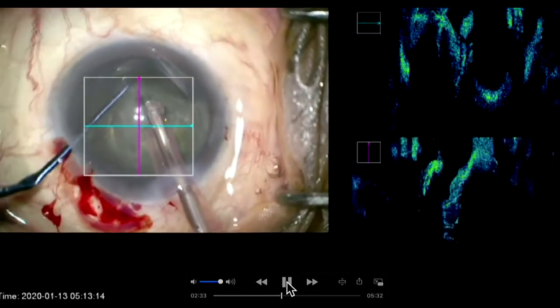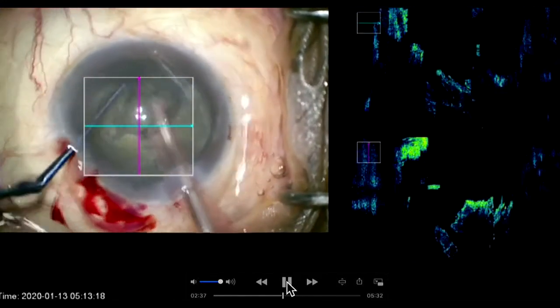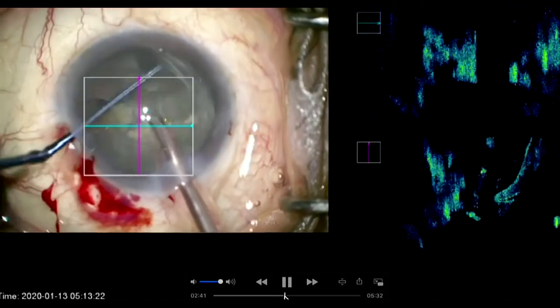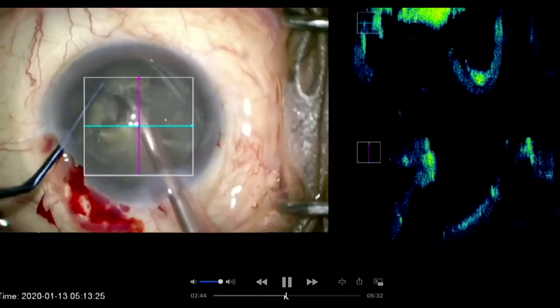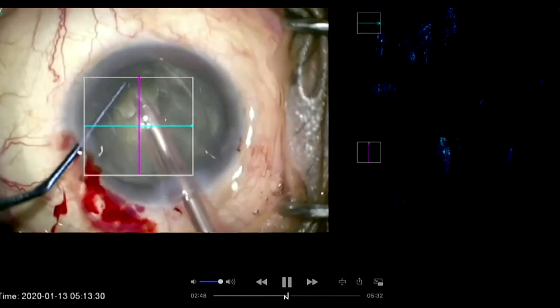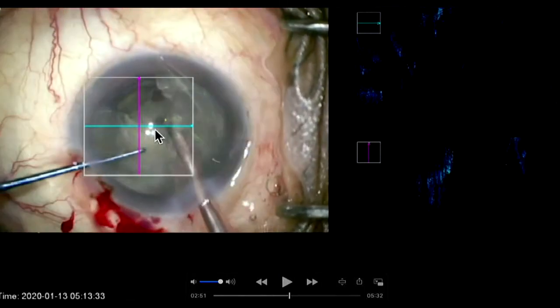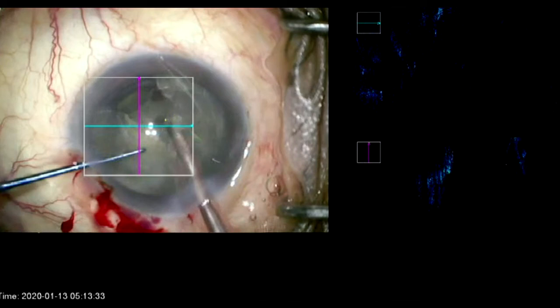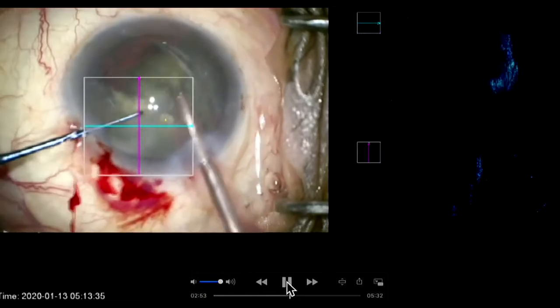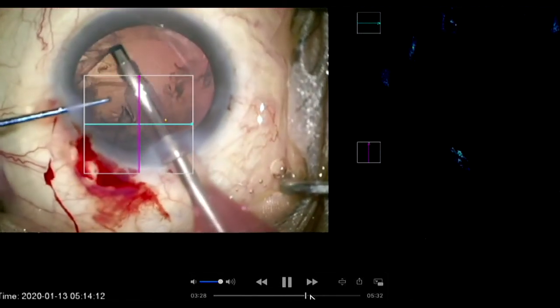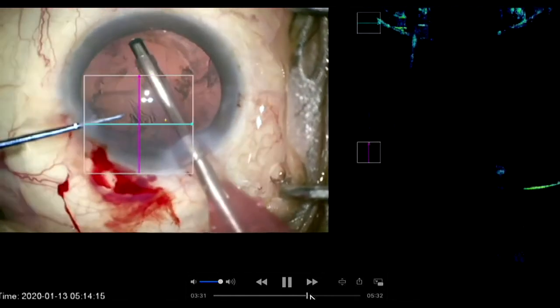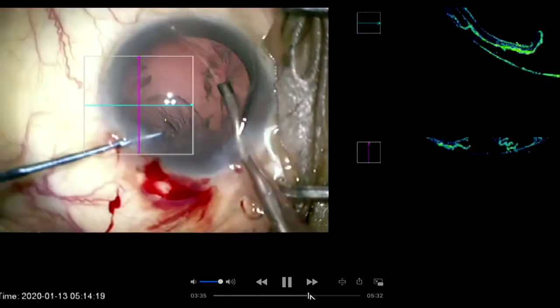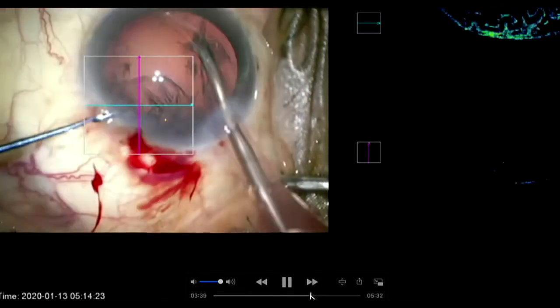Chopping has to be done from the periphery to the center, and all pieces should be fully separated. We do multiple pieces of nucleus chopping first, then emulsify one by one — that is an easy way to handle it. One important thing when chopping a piece: make sure you hold in the middle of the mass so that when chopping you have equal mass on either side, which reduces tilting. If you hold at a peripheral area, one side will have a larger mass creating compression towards the capsular bag. The nucleus is simpler to remove because we did a good hydrodissection. Good hydrodissection gives you access to better cortex removal; good delineation gives better access to nucleus manipulation. Both hydrodissection and delineation are important for routine cataract surgery.